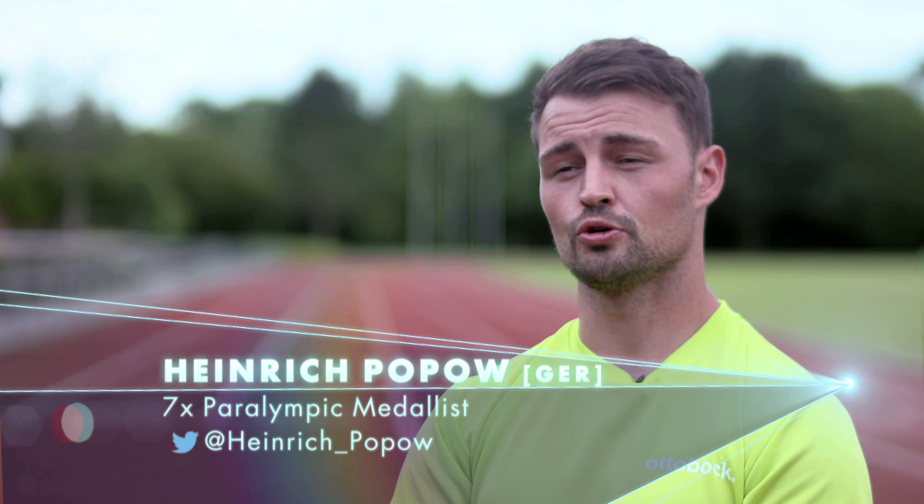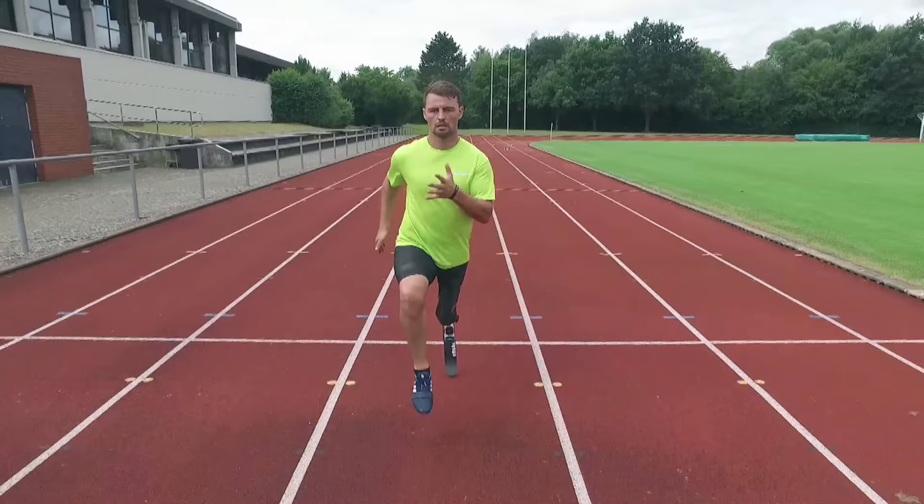I can produce speed, I can produce force, and I can run and I can enjoy my running. It's not a battle against my prosthetic — it's running with my prosthetic, and it becomes a part of my body.